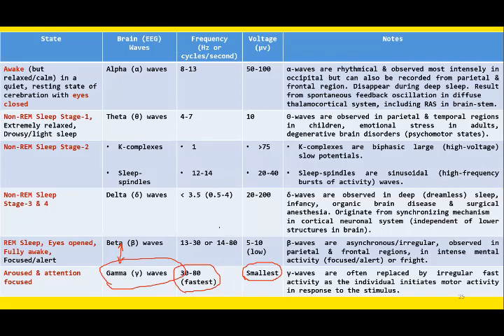We use this electroencephalogram to record the EEG wave pattern in patients of epilepsy or seizures. We can localize lesions within the cerebrum with the help of this procedure. We can localize hematomas like subdural hematoma with the help of this EEG. And then we discussed different types of EEG bands that are observed in either non-REM sleep or REM sleep.